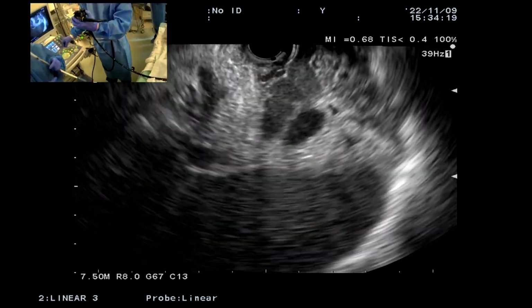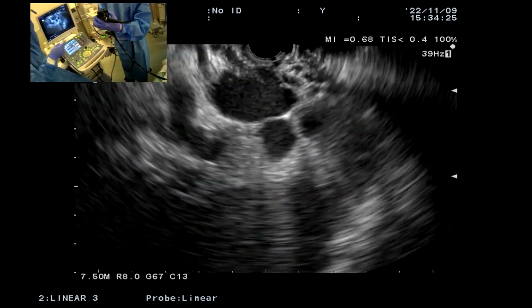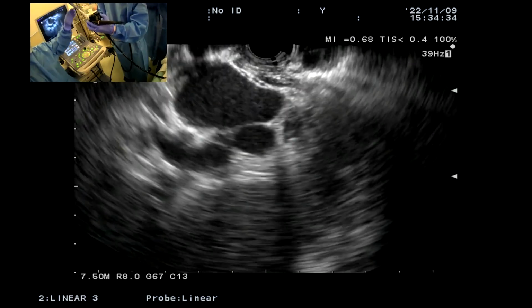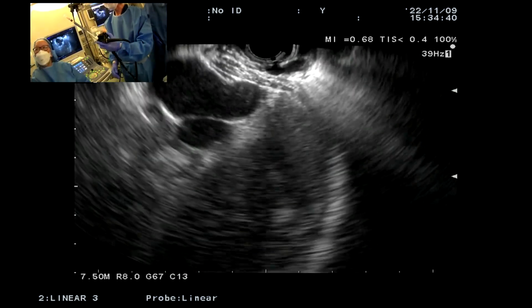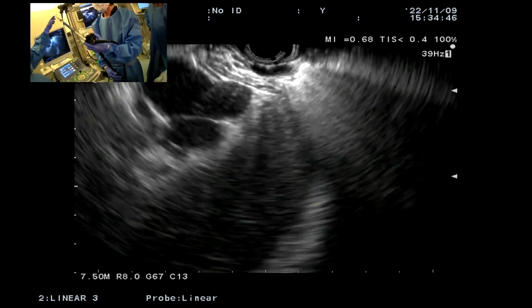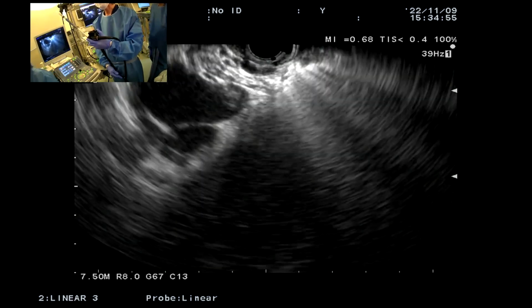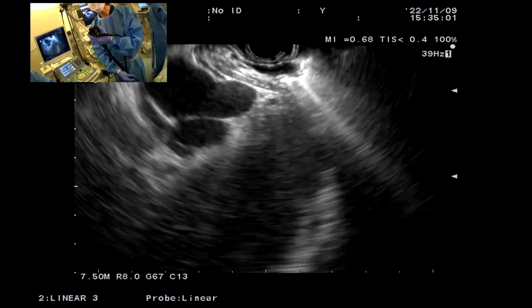So we'll go ahead and take the cap off and insert the 19 gauge needle sheath. Just a standard FNA needle, and this has been primed with water, so you can see that there is a syringe here. It's saline. We're using saline because we're using Dermabond, which is octyl-2 cyanoacrylate. It polymerizes more slowly, which is, I think, advantageous. To actually speed that up a little bit, we're using saline, whereas with HistoAcryl you would use distilled water.